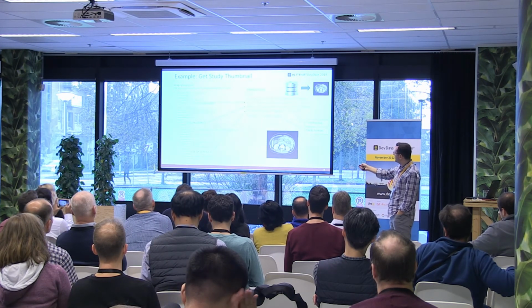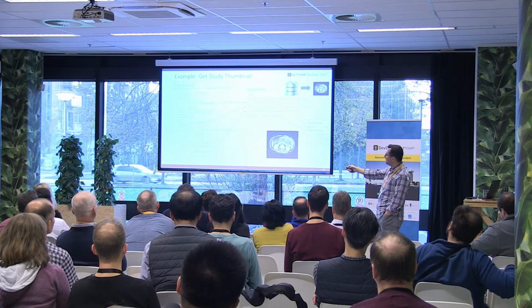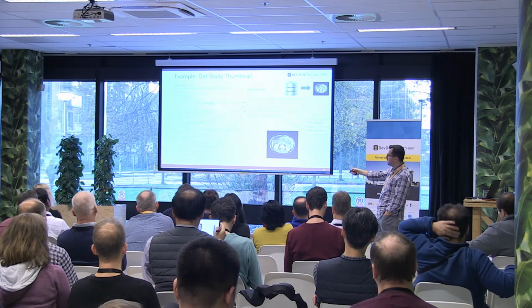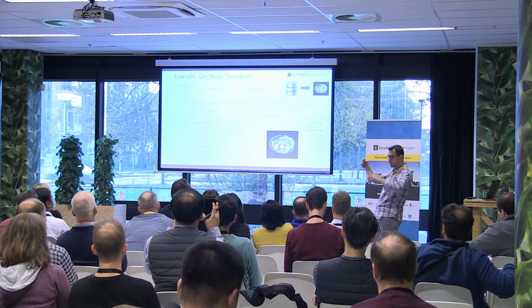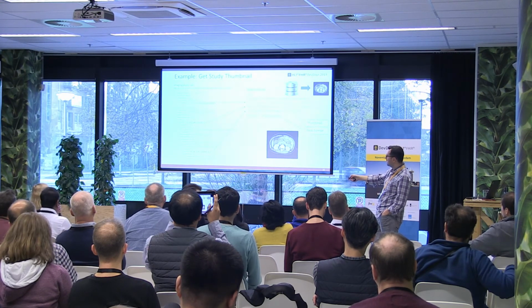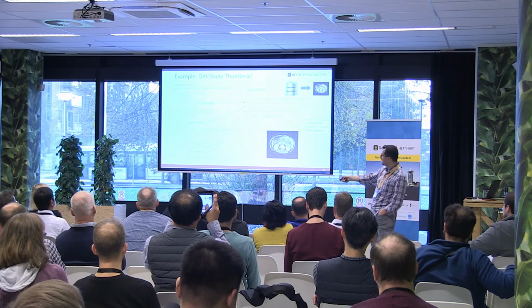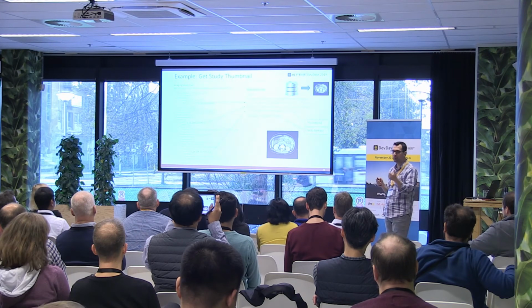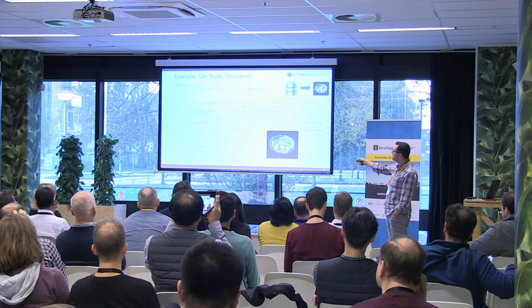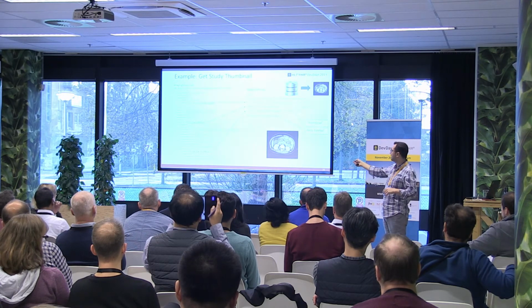Here's an example of how you could figure out what kind of call you could make. In here, we have an imaging study. There is the identifier of the study, and I've made this pretty short just to keep it simple here. They're usually a lot longer than that. And then within the study, you have a series. Within the series, you have the image. Now, the one thing I don't have in this example, because it's too long to fit, is the endpoint. Remember we talked about the endpoint attribute? I don't have it. But if you did, sometimes the endpoint may actually give you most of this already available, and then you just fill out the last part.